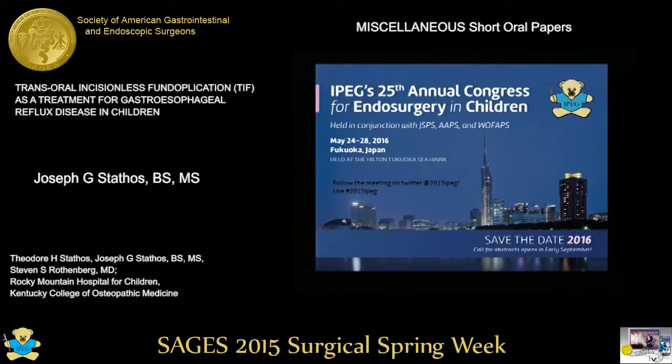Yeah, thank goodness we didn't have any malfunctions of the equipment. I could imagine it being a horrific experience because you essentially have a very large device sticking out of the mouth, and then if this was articulated inside the stomach, there would be virtually no way to get it back out.